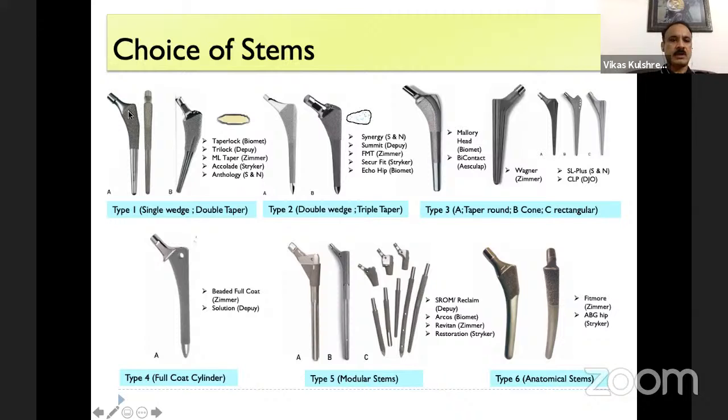So the biointegration is in the proximal, approximately one third or slightly more in some designs. Distally, they are smooth, tapering. They are just essentially for alignment. They do not integrate and they should not get stuck distally. They have these flutes to decrease their rigidity and increase biocompatibility and flexibility of these stems. And some of them have a lateral relief also.